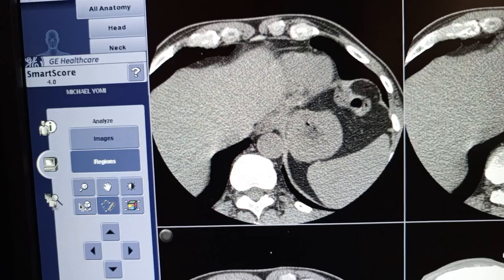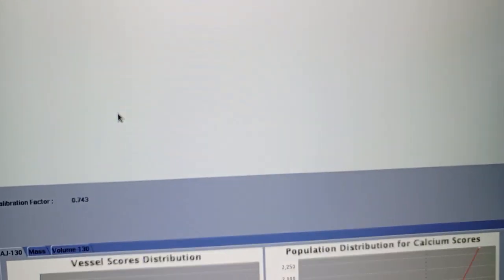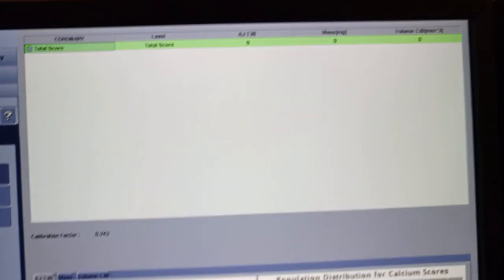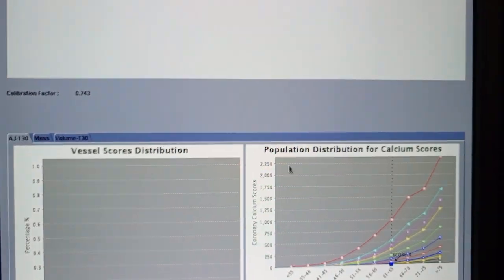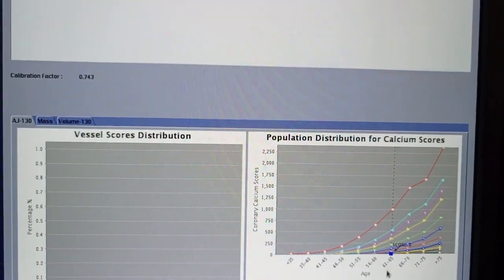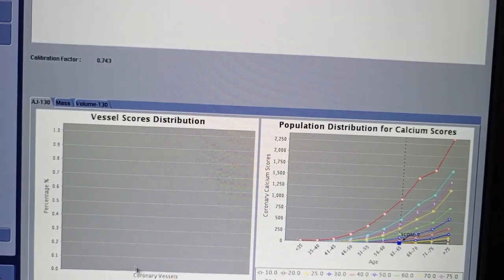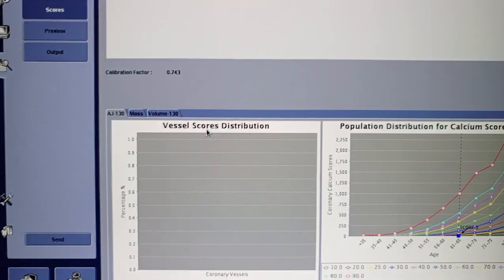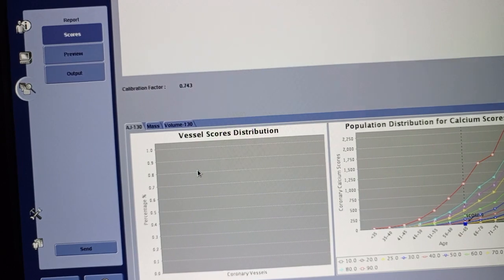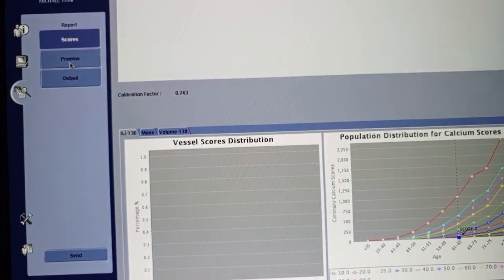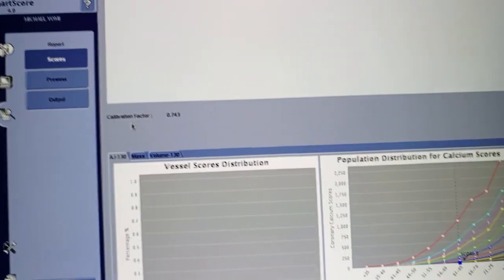From there you come to the report area. It generates the total score for you. In this case we didn't get any calcification. It also shows population distribution for calcium scoring based on the patient's age, and a versus-score distribution showing where any detected score would be distributed.